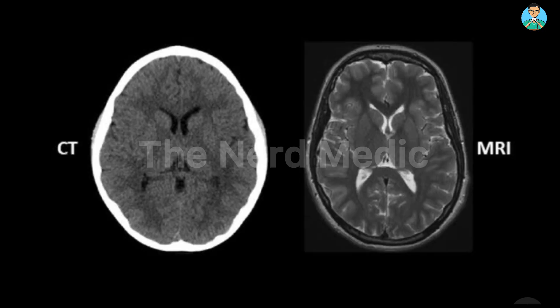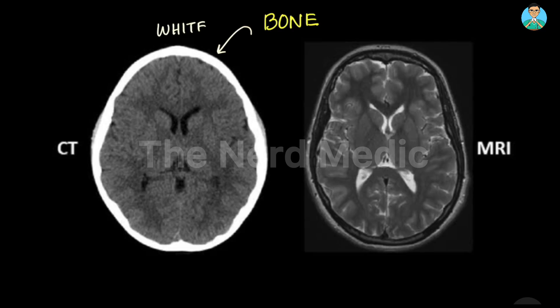One simple tip which can help you immensely in differentiating the two is looking at the cranial bone. In the case of CT scan, as you can see, the bone is white in color. However, in the case of MRI, the bone appears darker.